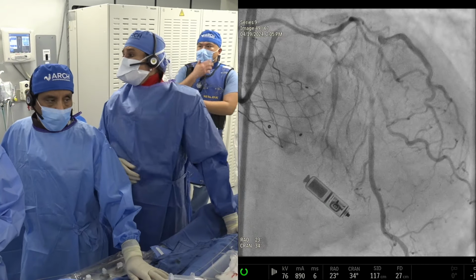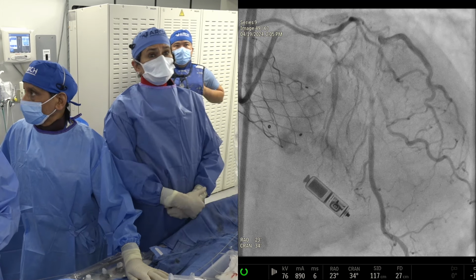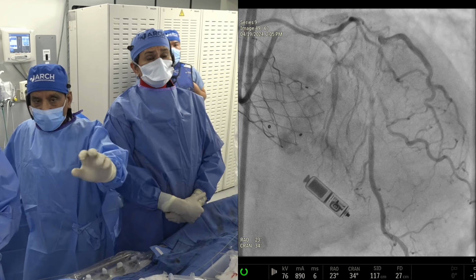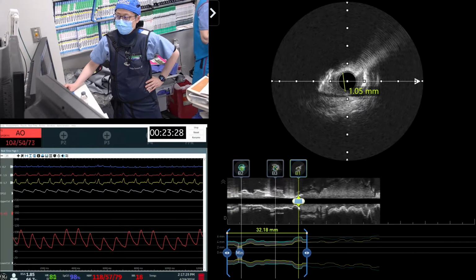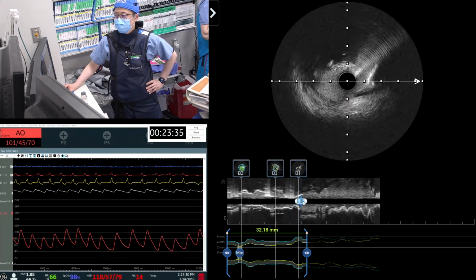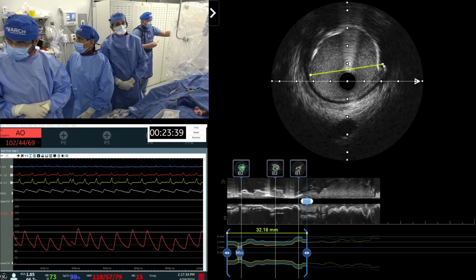Very good point. At the level of the nodule, get me the diameter. Sure. We can show the hemodynamics on one side, please, on the screen. MLD is like 1.0, very obstructive. Get the whole thing. Okay, so we have a 1.75 burr. That was our visual estimate. Probably will be the right choice at that level of the nodule.